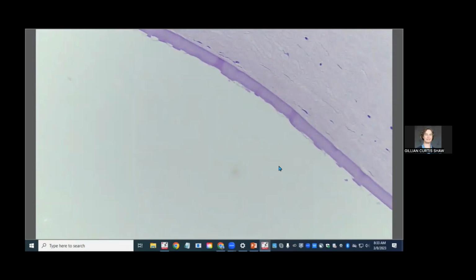So even though you have Descemet's membrane, or even a duplication of it, it does not provide a barrier to the influx of fluid to the cornea. Is that right? Yes. Okay, go ahead. Good question. So the question was, even though we have an intact Descemet's membrane and even a double Descemet's membrane, we don't have enough of a barrier to prevent edema.